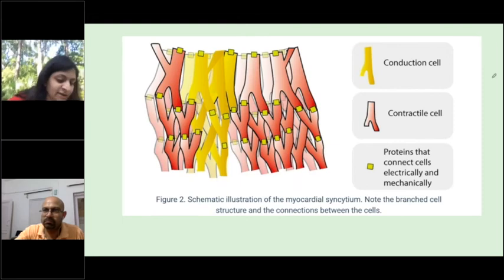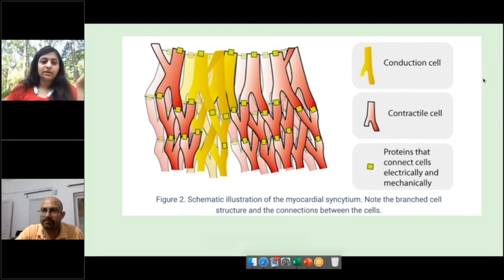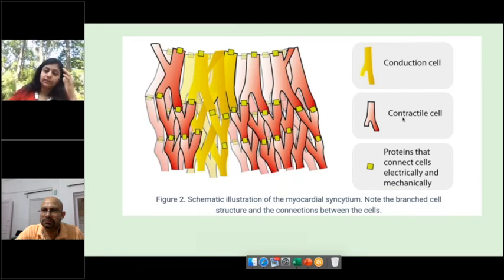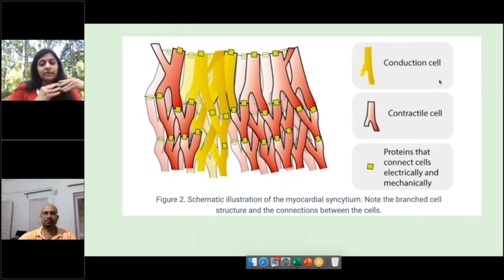So as we all know, electricity is flowing through the heart. Basically what you're doing in an ECG is you're just trying to see the flow of electric current through the heart, right? And as we all know, there is an area where the impulse generates. And then through certain cells, the impulse goes from one part of the heart to other parts of the heart, right?